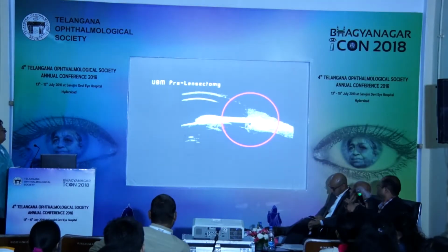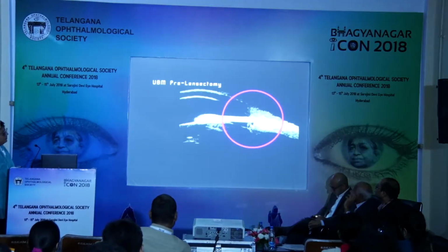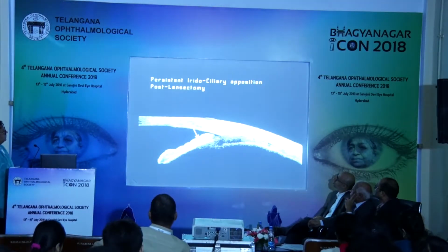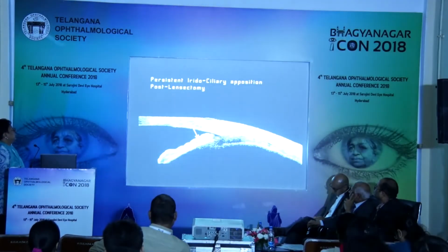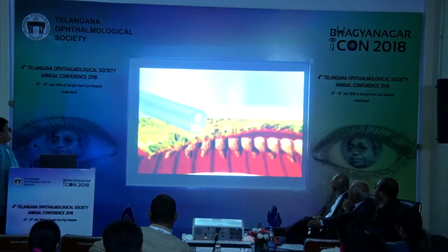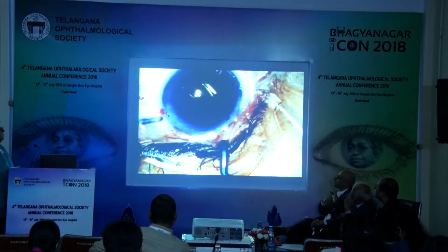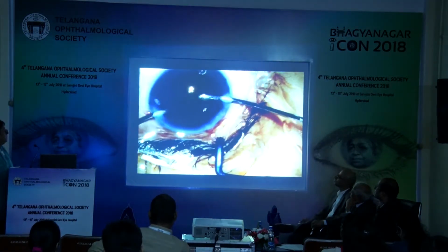Ultrasound biomicroscopic studies performed before and after lensectomy demonstrate that iridociliary apposition seems to persist in plateau iris syndrome despite cataract extraction. Of late, endocycloplasty combined with phacoemulsification has been used to change the angle configuration.